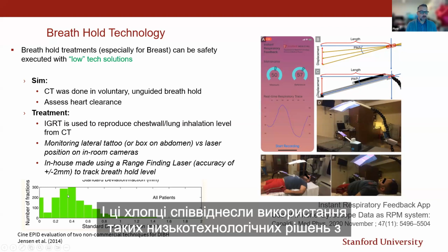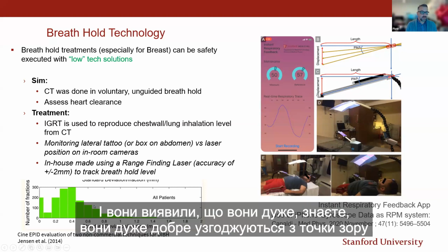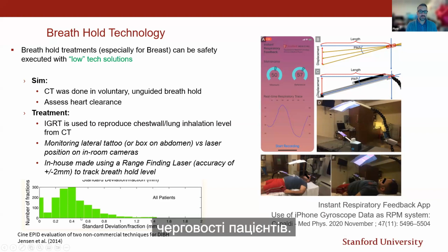And these guys correlated the use of these kind of lower tech solutions to the RPM system, and they found that they agree very well in terms of lining the patients up.